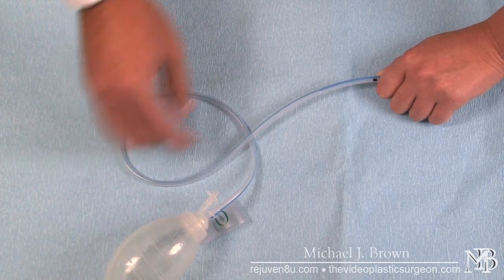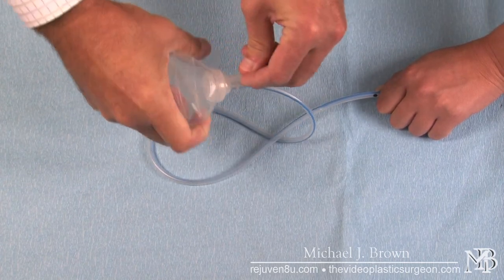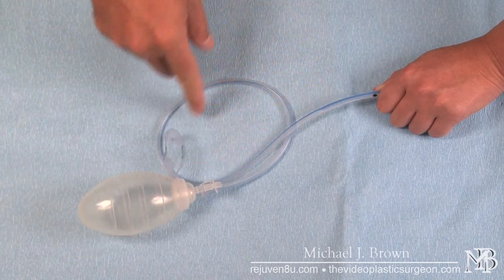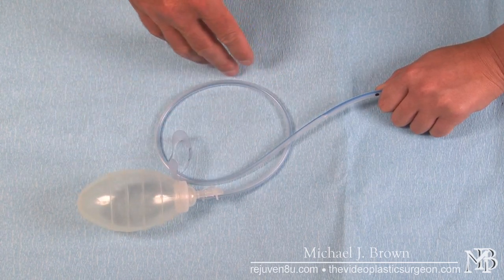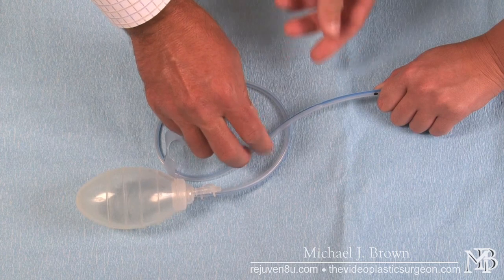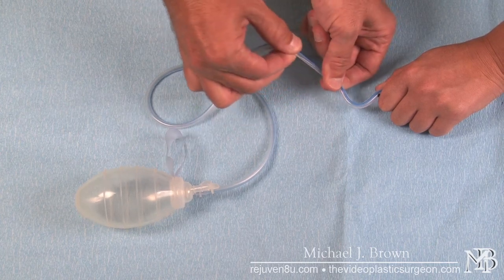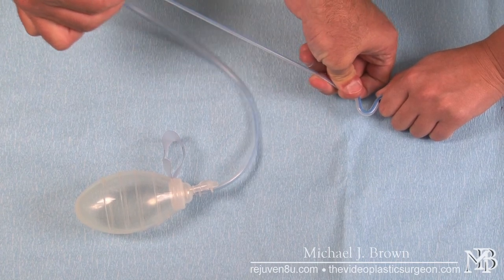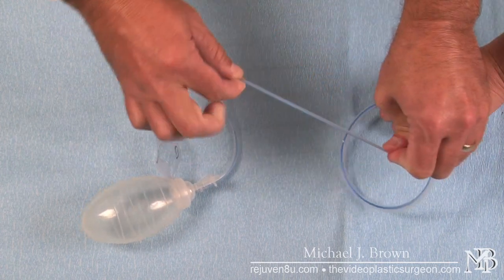The only other thing you have to do is what's called stripping the drain. As the drain sucks fluid in, it will also suck in some blood, and that blood will tend to clot in the tube. If the tube gets clotted, the drain stops working. So what we have patients do is take an alcohol pad or a face cloth and hold the drain close to the body so they don't pull it out, then gently pinch and pull the drain. You can see I'm actually stretching the drain — my fingers are not moving — then I lightly let my fingers move and go down the drain, working any clot into the tube.